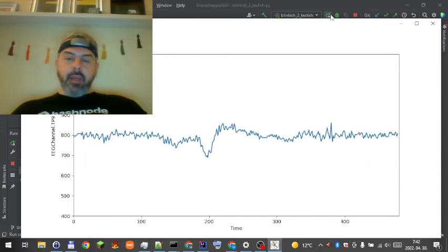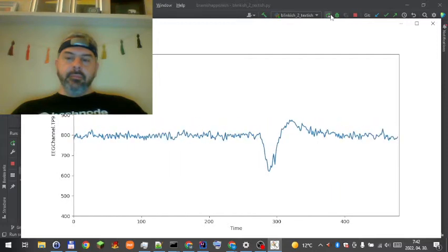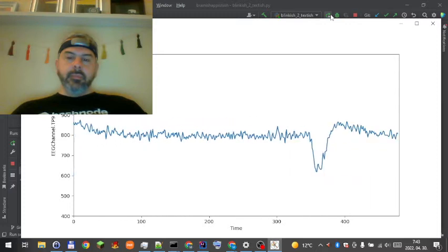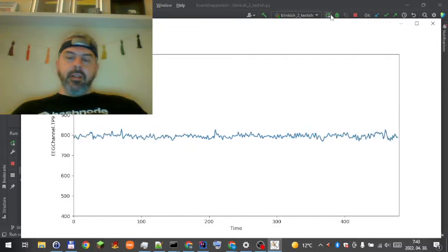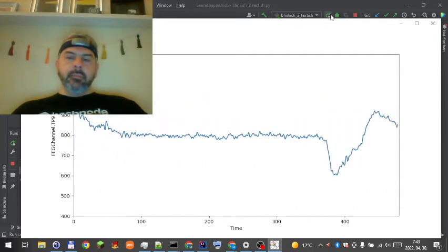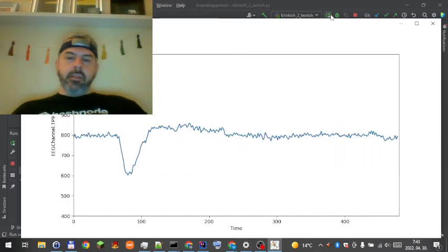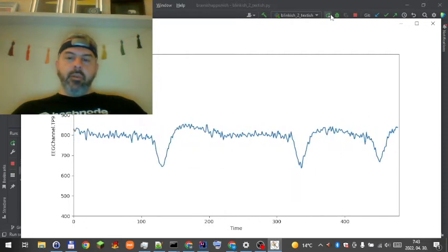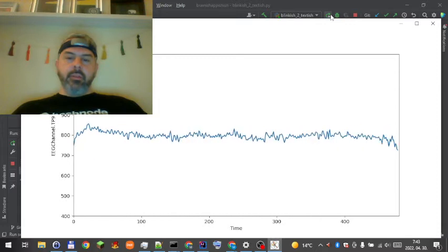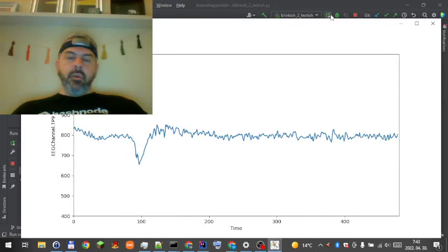Okay, so let's look at the eye blinks. This is a normal eye blink. You see a huge drop, then coming back, and it overshoots a little bit. Okay, then let's do a short blink. As you can see, it takes longer, it goes down the same way, but it takes much more time to come back to the normal value. So I think this will be good enough for me to detect the length, but let's see a long blink.